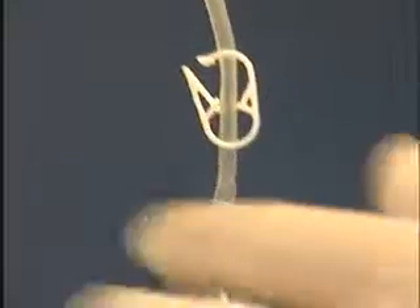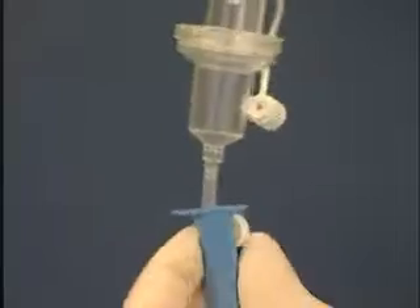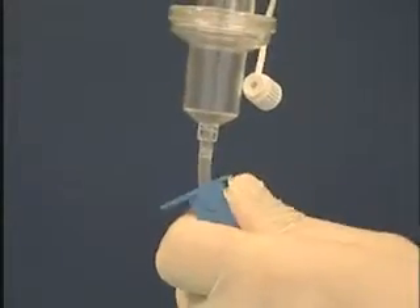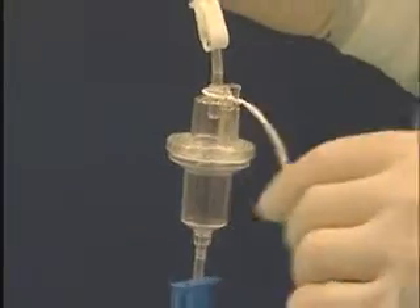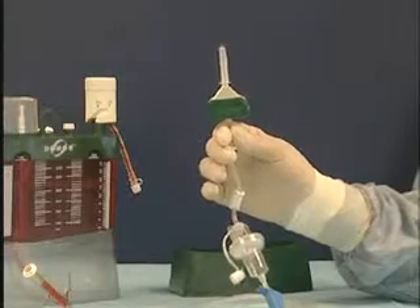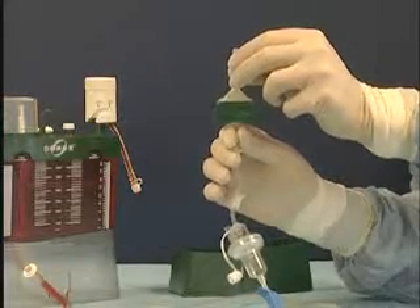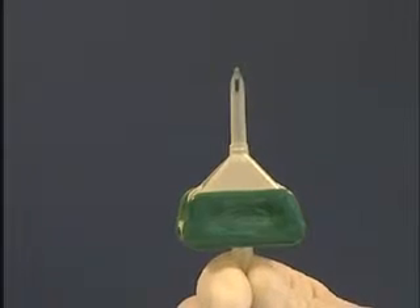The tubing clamp and the roller clamp are both closed. At this stage, the white protective cap of the drip chamber is hanging free. We remove the transparent protective cap from the filter set spike and firmly insert it into the connecting tube of the donor system.